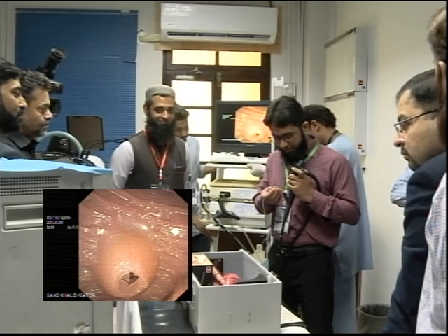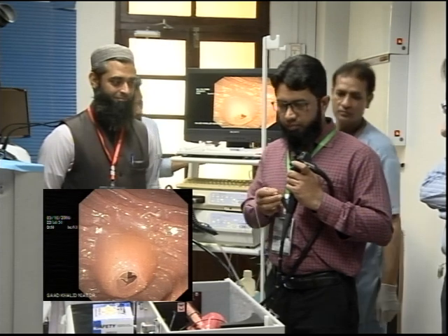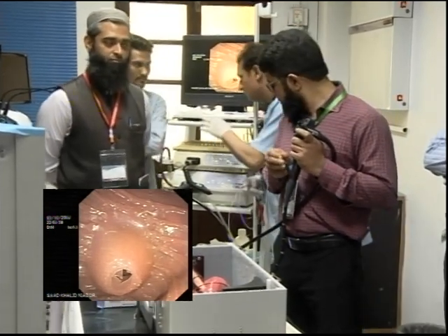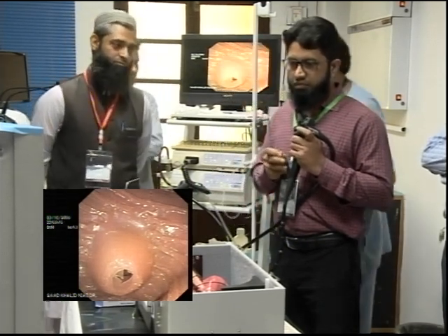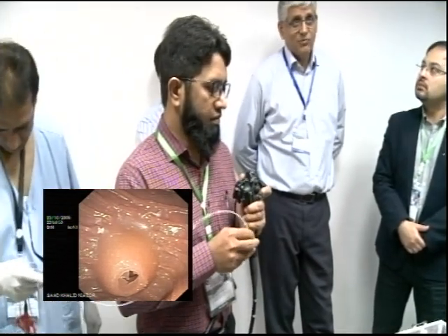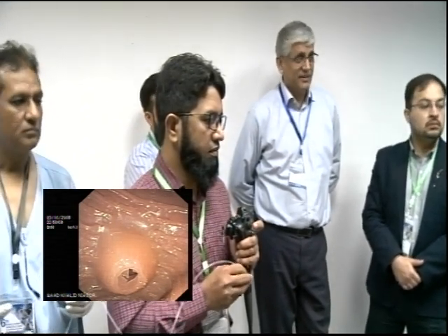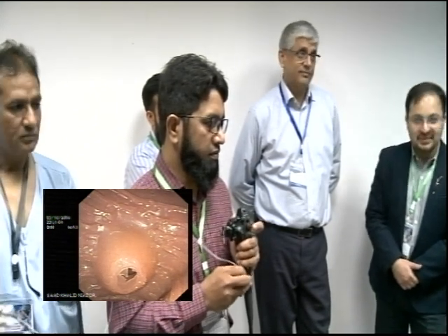Good. So this is not bad here. In ERCP, it's very important to have some kind of communication and good understanding with your tech. You cannot do ERCPs without your tech's support. Now, there may not be a tech, there may be a colleague, but you need somebody on the other end. If it's a good tech, then he or she will understand what you want and make life very easy. And if he or she is not well trained, then God bless you, because it's going to be very tough.